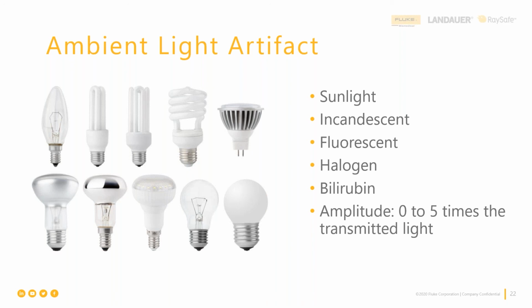So in the test instruments that we provide you, we give you ways to inject or produce some of these artifact signals so that we can see how the pulse oximeter does in terms of its proper measurement and display of O2 saturation values. So these are some of the things that we can introduce in terms of light artifact and things that actually do get in the way in real clinical use.